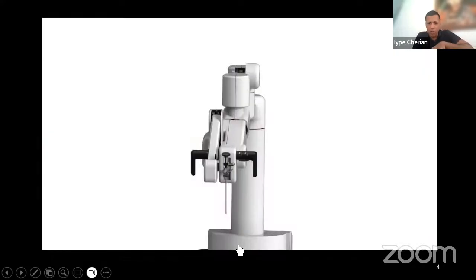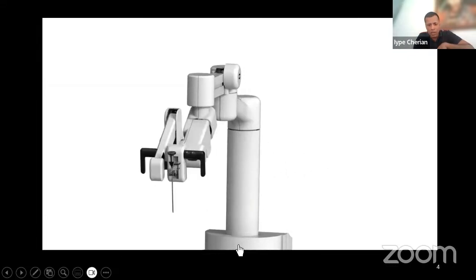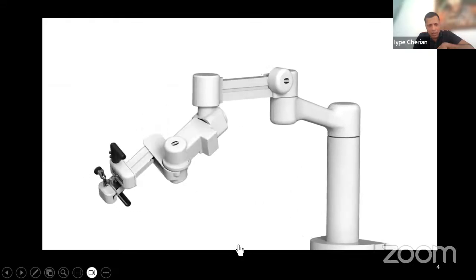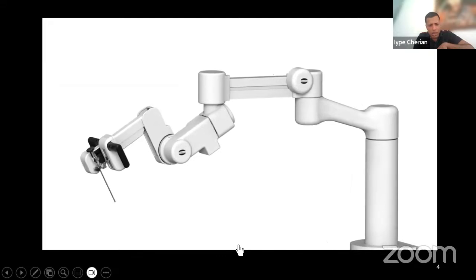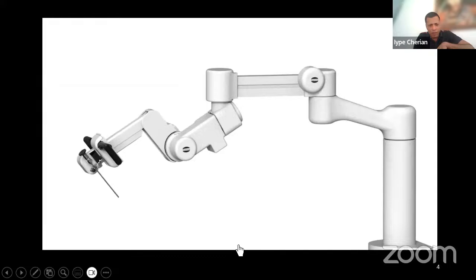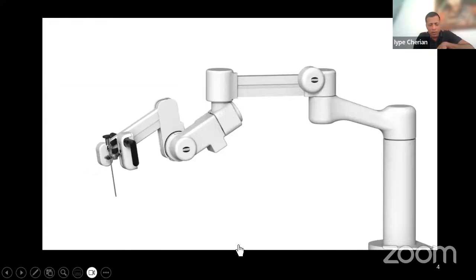This is the robotic endoscopic holder that we have designed for this scope, cranial assist, and this can also work for transnasal, transventricular, everything. So you can see it's got 7 degrees of freedom, and this is with Sanma, an Indian company. And I must say, I must commend that they have done an excellent job. We used to have the Mitaka holder before, the pneumatic arm, but I can say that this is far better.